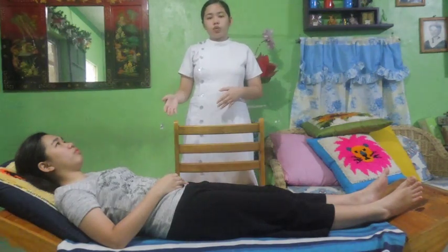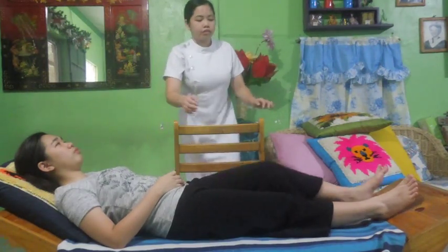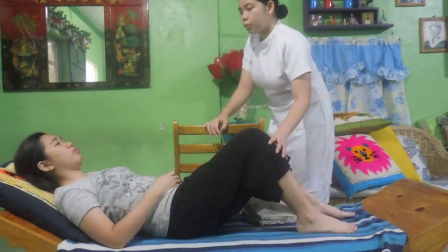So ask your patient to position their foot and their arm. Ma'am, can you position your foot, bend your knees so that it eases to move you. Ask your patient to keep their head up when moving and flex their neck when they go up in the bed. And make sure you use a friction reducing device. Assume that there is a friction reducing device to move the patient.